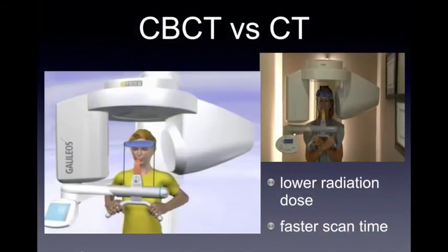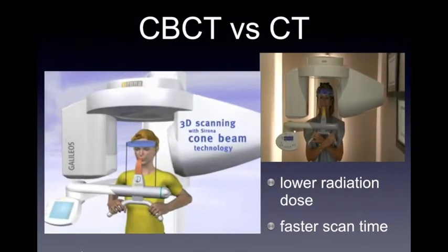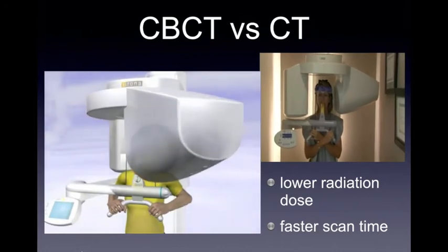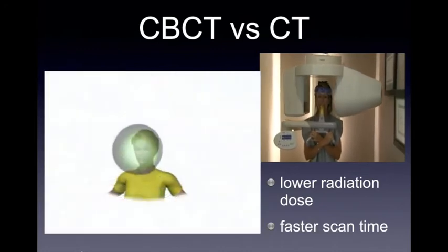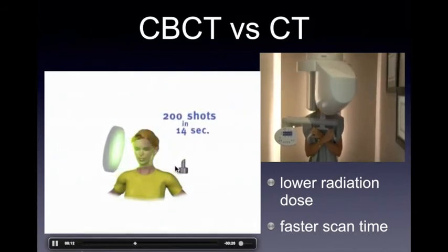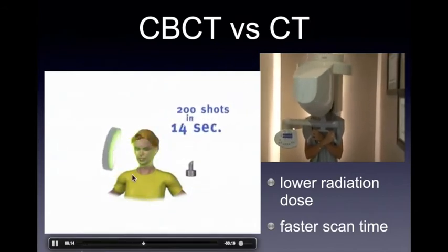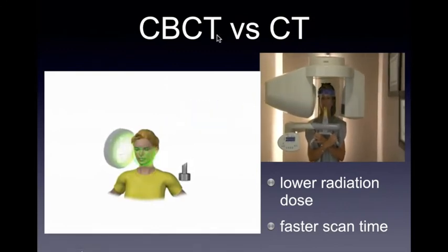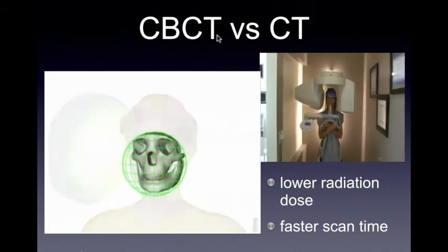So if we look at how this was made possible, I use this YouTube animation and actual shot of how CBCT is taken. It actually utilizes the entire cone beam of our radiation.